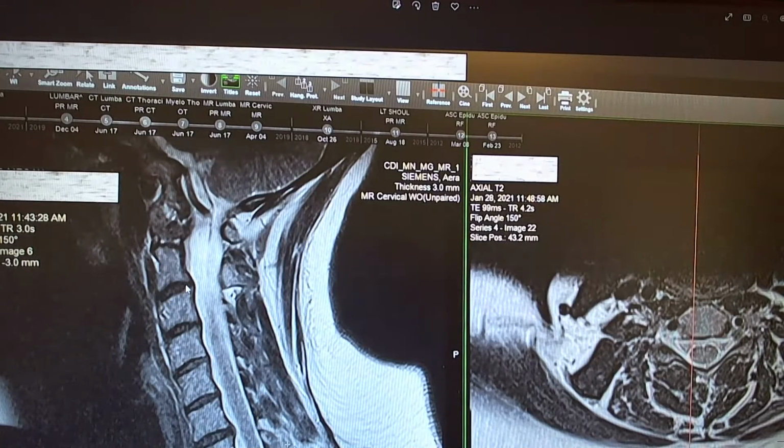I know that is not a big hit, but if you now understand how the T1 and T2 are produced, you understand what they represent and why it is important to see them both. Neil says T1 anatomical, T2 pathological. Yes. Okay. So let's go to the next.